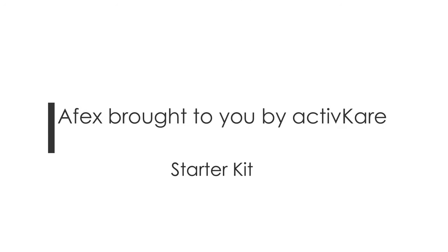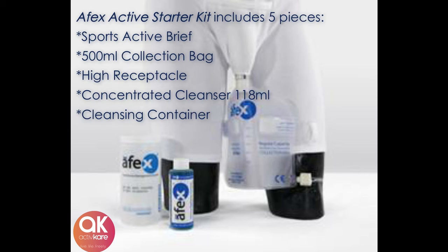Apex for Men's Urinary Incontinence by ActiveCare. The Apex Active Starter Kit is 100% made in the USA and comes equipped with an Active Style White Cotton Brief, 500ml Vinyl Collection Bag, High Style Penile Receptacle, and 118ml Concentrated Cleanser and Cleansing Container.